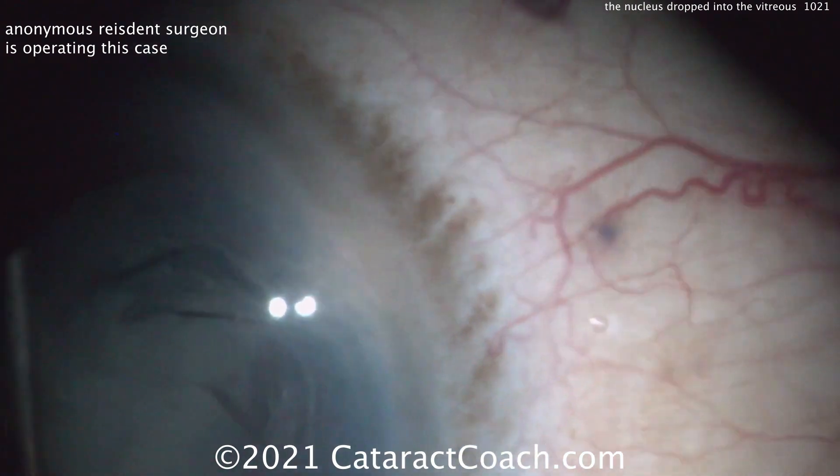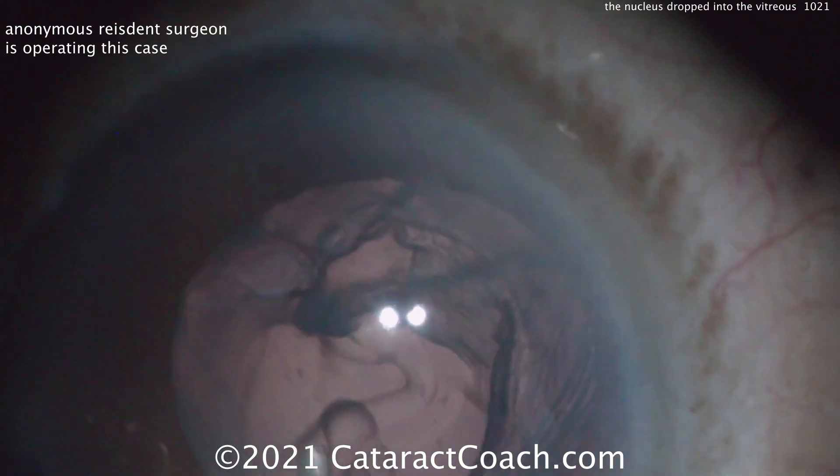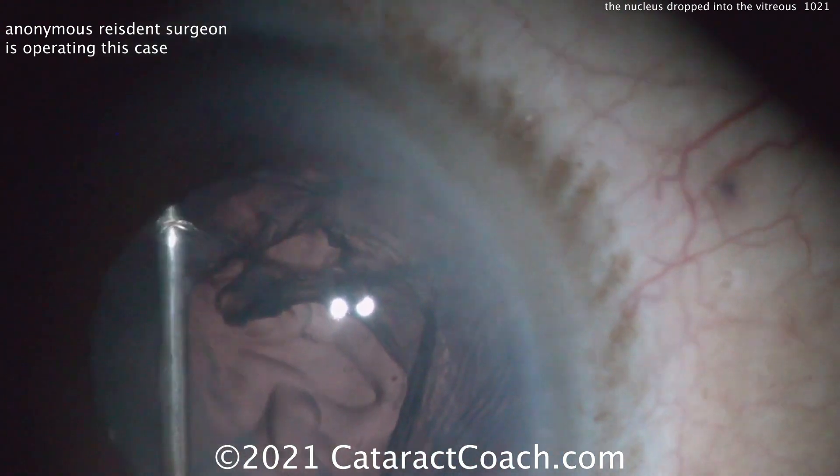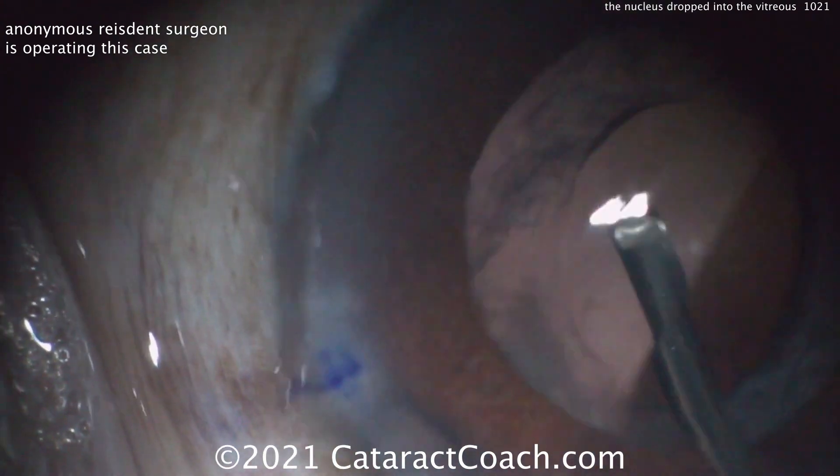You can see there's a lot of cortex remaining — that has to be cleaned up. Time to accept reality: the nucleus is already in the vitreous cavity. You are not getting it up right now. This patient will need to go to your vitreo-retinal colleague for a pars plana vitrectomy, pars plana lensectomy. That's okay.